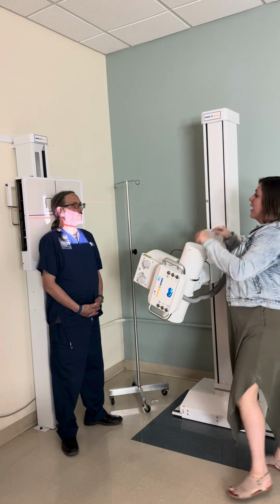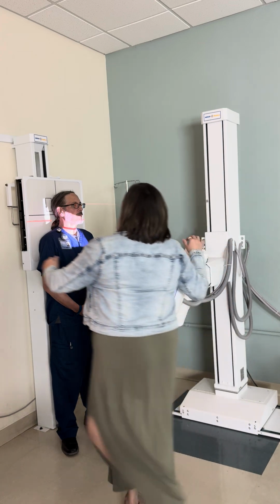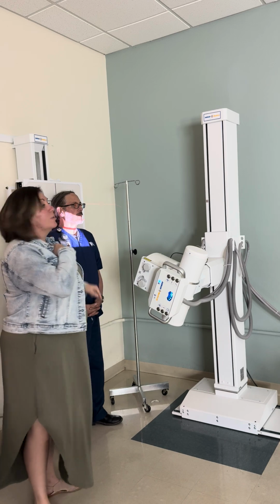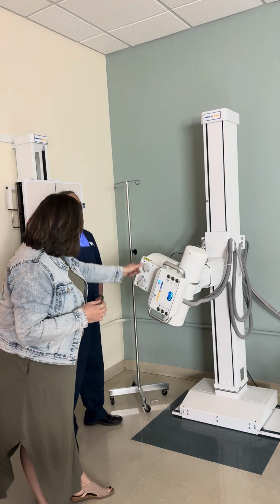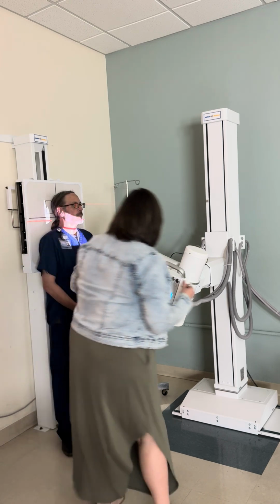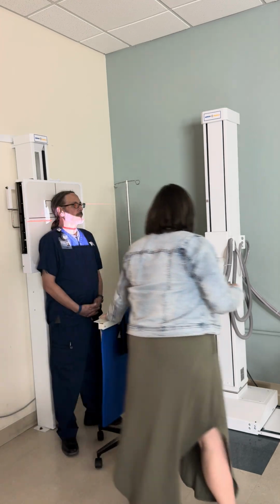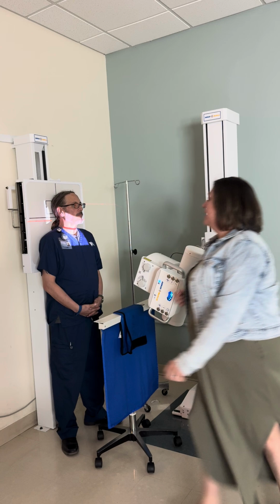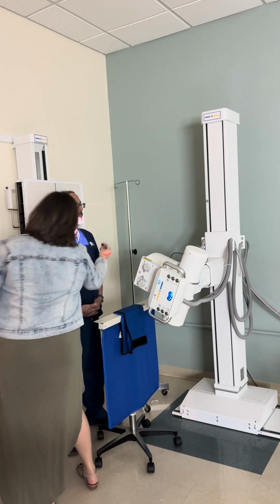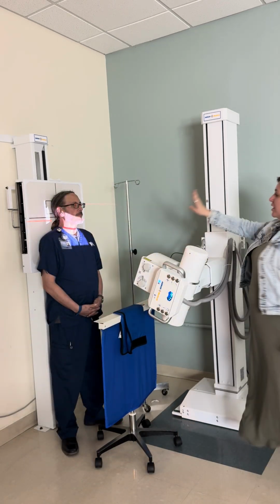We want the light field to be coming above the, I'm gonna come down a little bit. We want the light field coming above the ears to the EAM, okay? And then we wanna make sure we're seeing some of the T-spine as well. So you can probably collimate top to bottom a little bit more. Good, and then we're going to roll the shield in front of our patient here. And then my left marker, which is up here, can go on the left side of my patient in the light field. Right there. So, left marker's here in the light field.